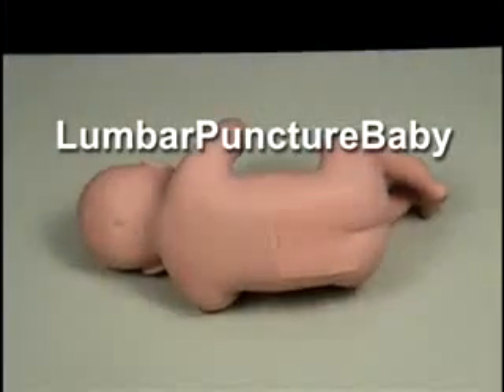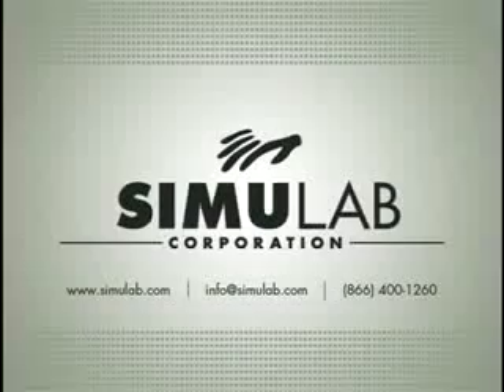Thank you for your interest in Simulab's Lumbar Puncture Baby. For more information, contact Simulab Corporation's Customer Care Team.